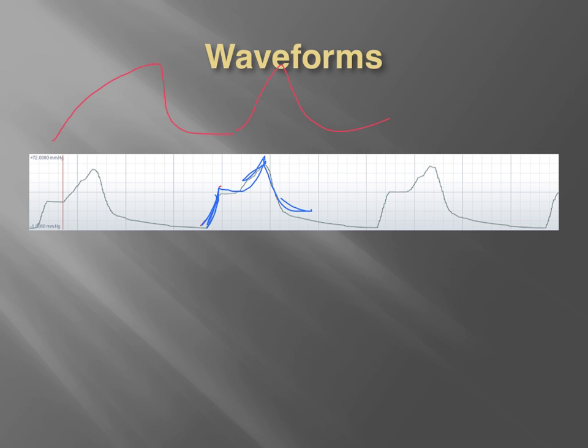So, another abnormal waveform. If we see something like this, we really have to look at correcting the cause. And in this case, this patient had to be treated very aggressively. Not only were we doing inline nebulizers, we were also going the route of magnesium sulfate for this patient to reverse that constriction of the bronchioles as quickly as possible, which in this case mag sulfate is completely justified.